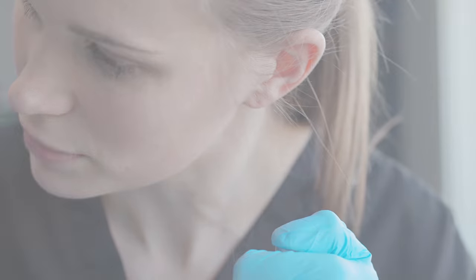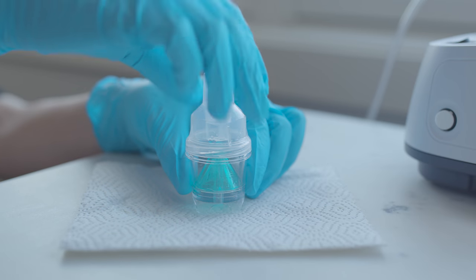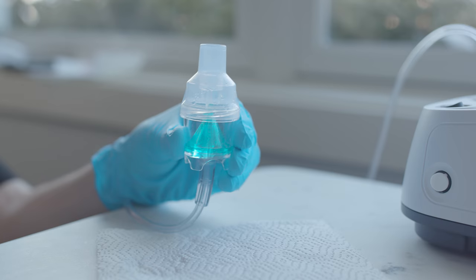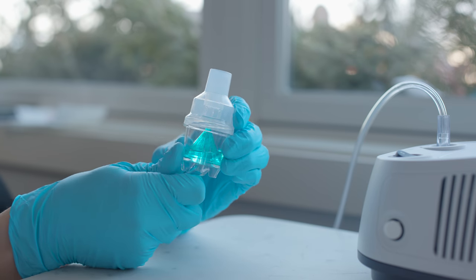replace the neb tubing. Check to make sure the neb cup is properly assembled. Attach the neb cup to the neb tubing. If there is still no mist, attach a new neb cup.